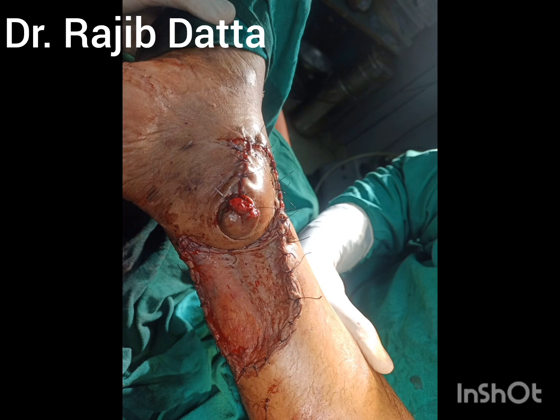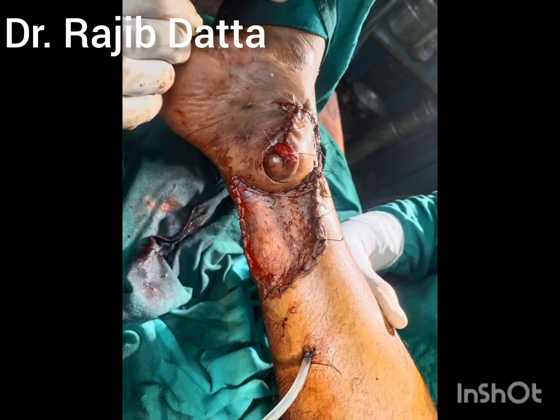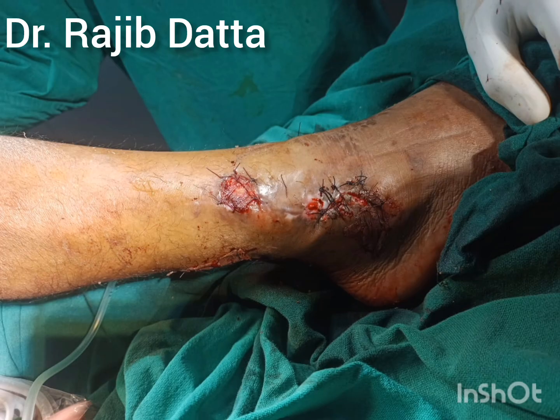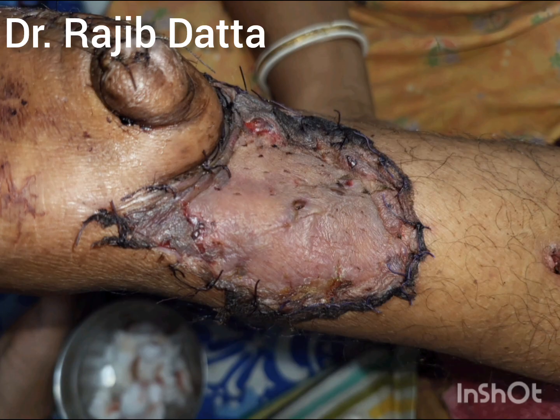After complete OT, the split thickness skin graft has been placed on the medial aspect and the proper positioning of the flap has been achieved, and a closed wound suction drain has been placed for the collection to be removed. On the lateral aspect, the proper split thickness skin graft is given. After 1 week, post-op first dressing, see the graft area.